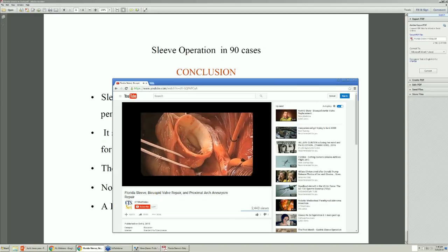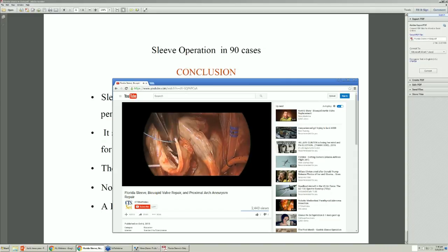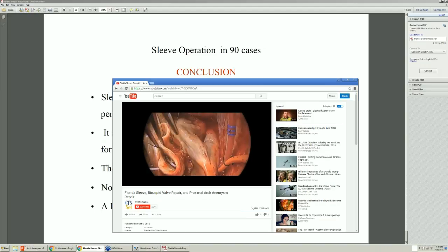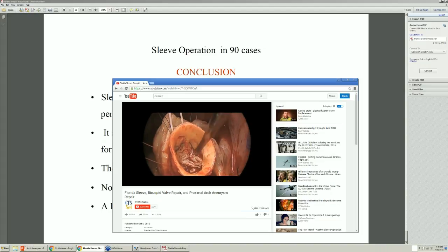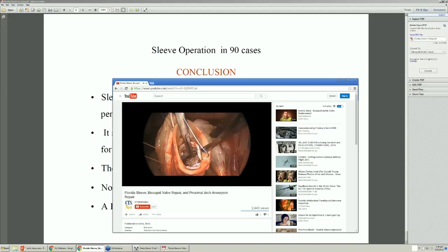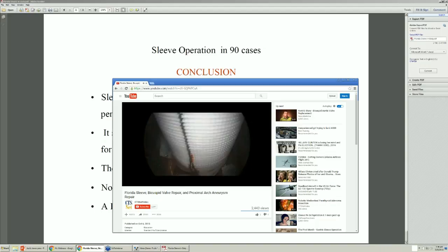Next, we are going to be placing anchoring sutures in the virtual basal ring underneath the aortic valve and externalizing these sutures outside of the aortic root tissue. Very similar to a valve-sparing reimplantation procedure or David procedure. In this case, we used 4 anchoring sutures, and once the sutures are passed, we're going to pass them through our graft, which was specially created for the procedure.